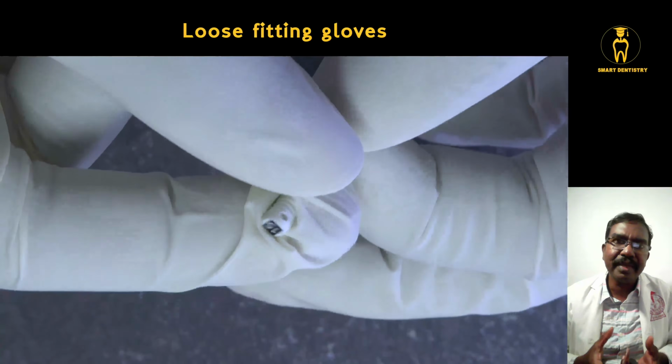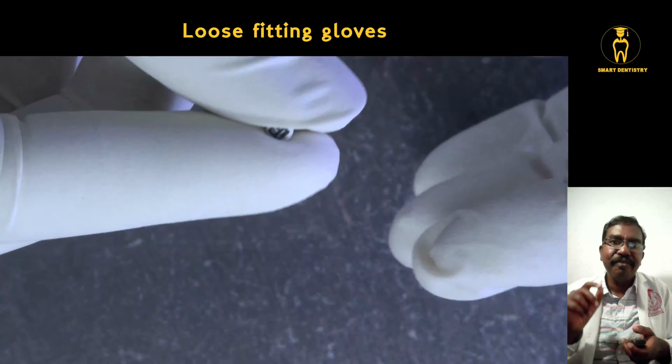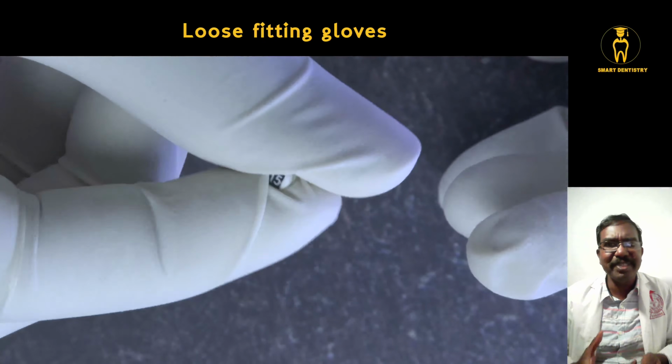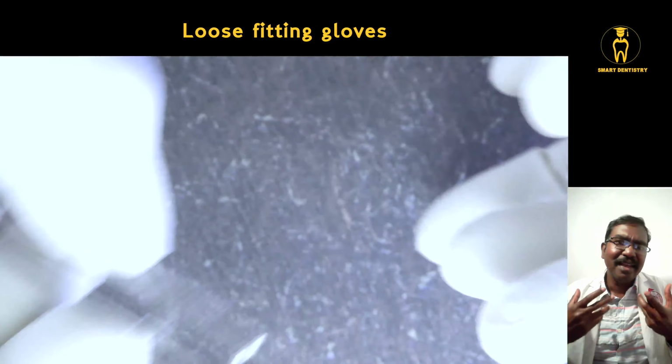So what's happening is, the loose glove is getting rolled over the file whenever we are doing a canal negotiation. Once this happens, there's no way that you will be able to negotiate the canal easily.